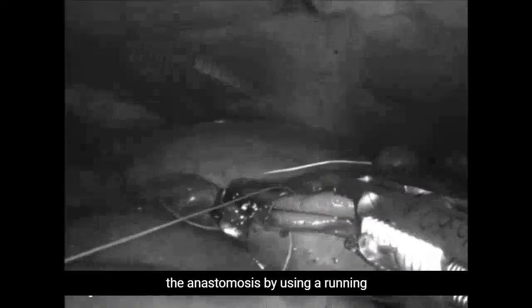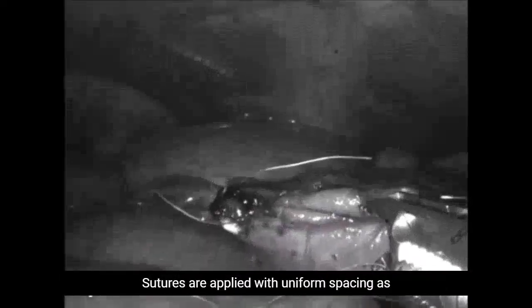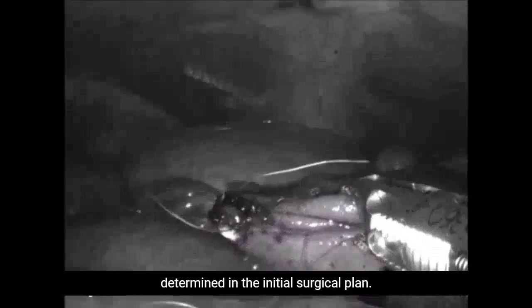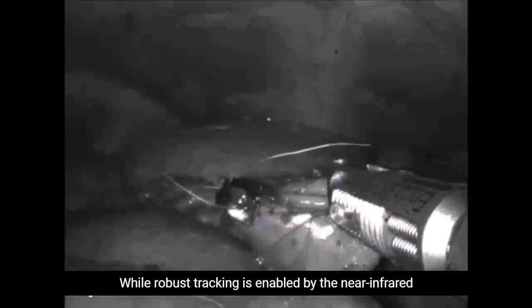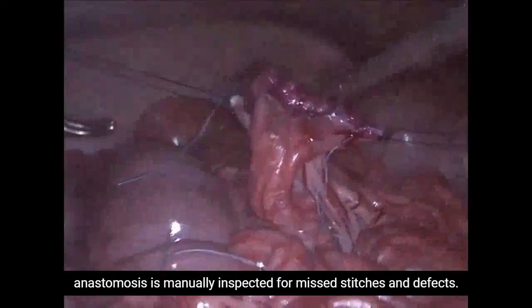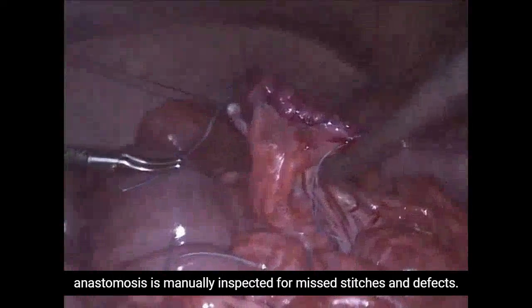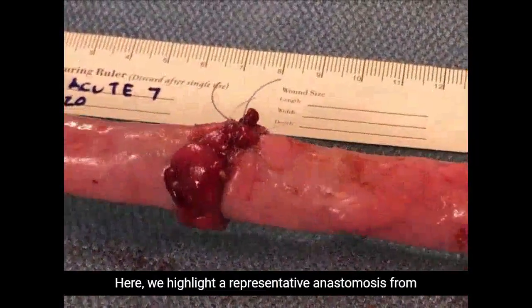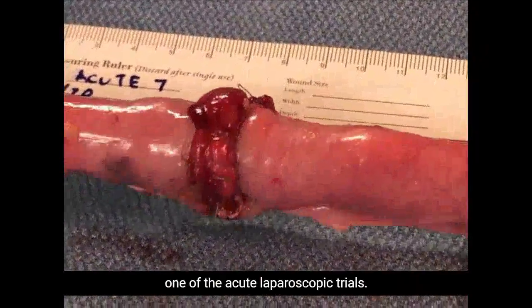Similarly, STAR completes the second half of the anastomosis by using a running stitch to close the front wall. Sutures are applied with uniform spacing as determined in the initial surgical plan, while robust tracking is enabled by the near-infrared imaging system. At the end of the surgery, the anastomosis is manually inspected for missed stitches and defects. Here we highlight a representative anastomosis from one of the acute laparoscopic trials.